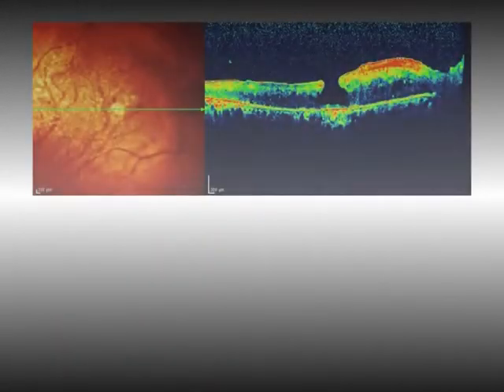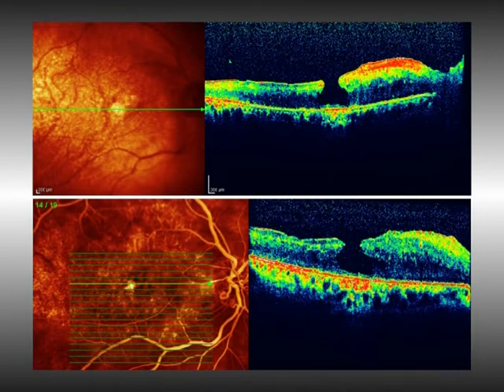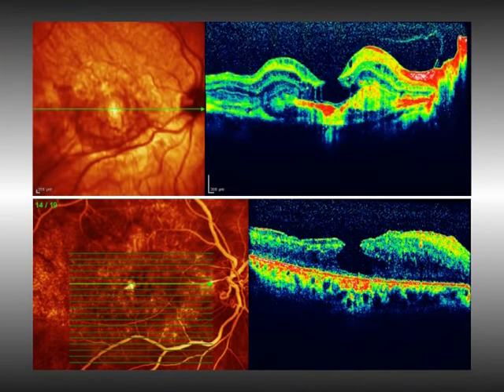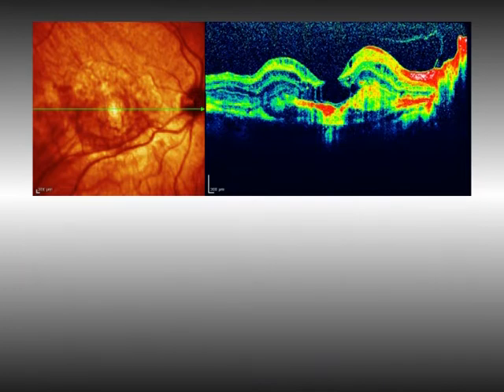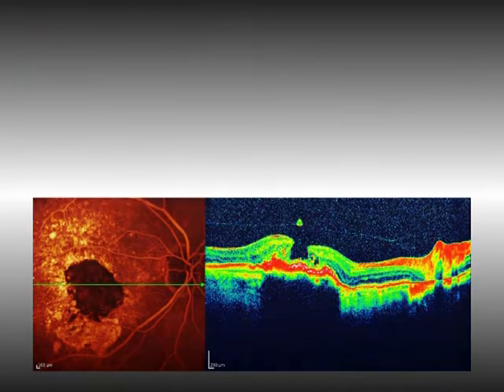Finally, we can observe similar non-full thickness fovea defects in an eye where nutrition from the choroid to the central retina is defective, like in age-related macular degeneration or diabetes. In these eyes, we usually observe no epiretinal membrane, but advanced pathologic changes in the subretinal tissue.